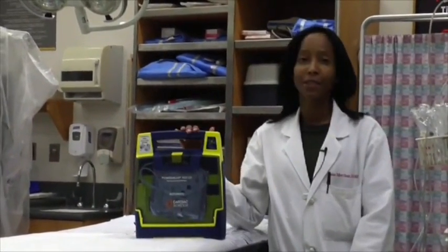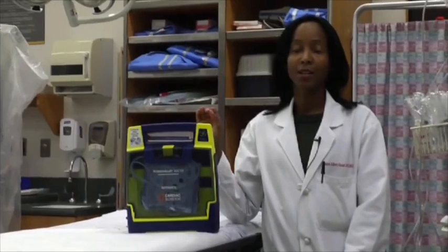Hi, my name is Dr. Raina Merchant, and I'm an emergency medicine physician at the University of Pennsylvania. I'm going to share very briefly with you some information about a life-saving device which you could use in the event of a cardiac arrest. So this device is the Automated External Defibrillator, or AED. So AEDs can significantly improve survival when coupled with CPR from less than 2% to 50%. So this is in cases when somebody stops breathing and no longer has a pulse.